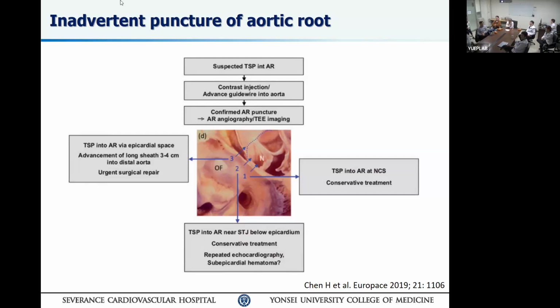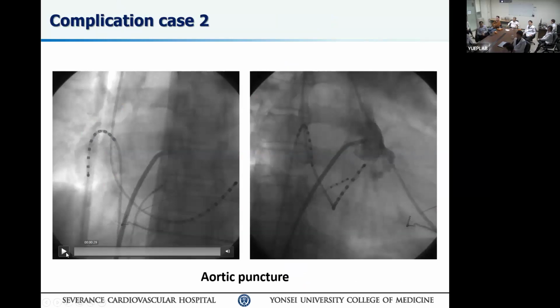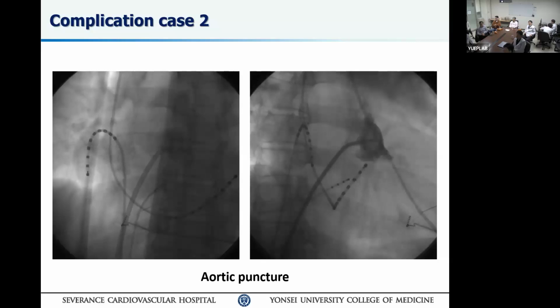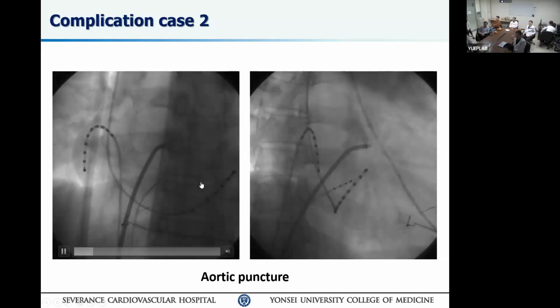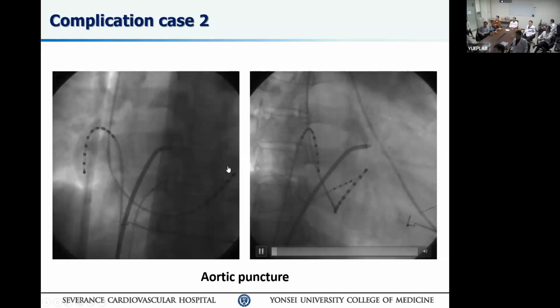the same image that you did show us. Can you go back there? I want to point out something quick for you. No, before that one, you had the real-time image there, yours. I don't know who that was. It's this one. I want you to look at that sheath. What is that around the sheath? What is leaking there? You see that dye leaking right around the sheath? Look carefully. Continue playing the right side, the best view. Keep playing that picture. Yeah, that one.